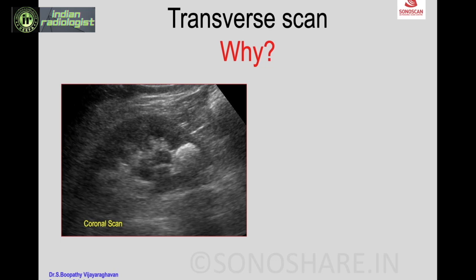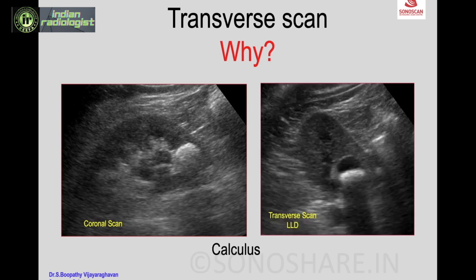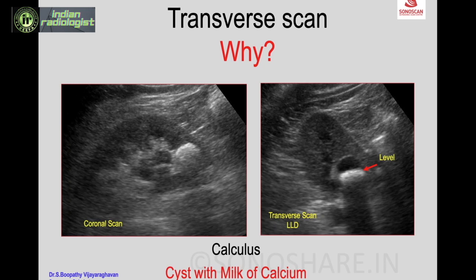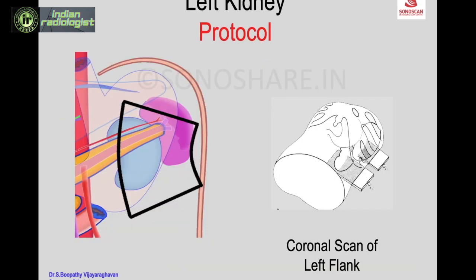Certain diagnoses are section-specific and will be obvious in a transverse scan. Here on a coronal scan you see what appears to be a calculus in the lower pole, but in the left lateral decubitus position you see that there is actually a cyst in the lower pole with a fluid-fluid level, indicating milk of calcium within a cyst — an entirely different diagnosis that does not need intervention, unlike a calculus which requires removal.